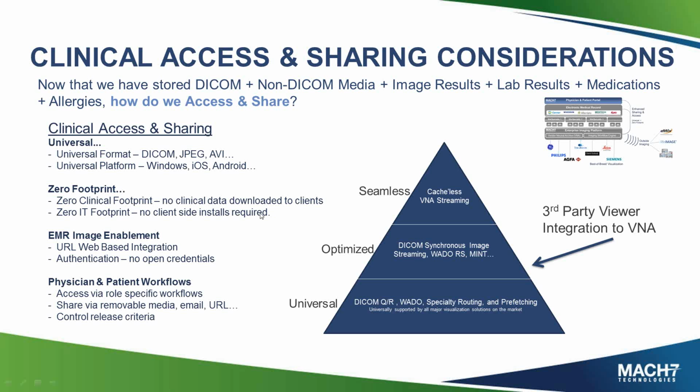And then even beyond that, I call it the seamless approach. We're starting to see more and more viewer vendors directly integrate to VNAs through APIs that go directly to the storage device. So obviously that's the fastest and best option from a speed perspective.